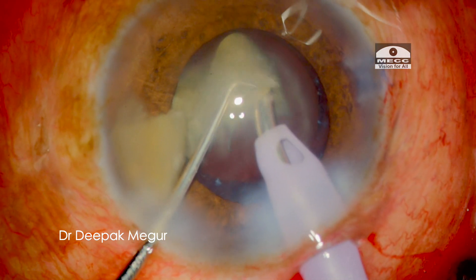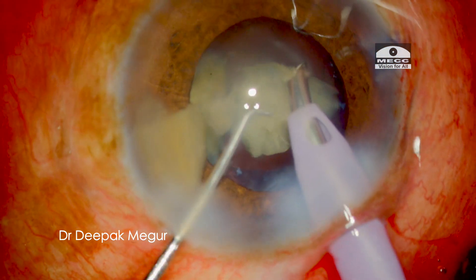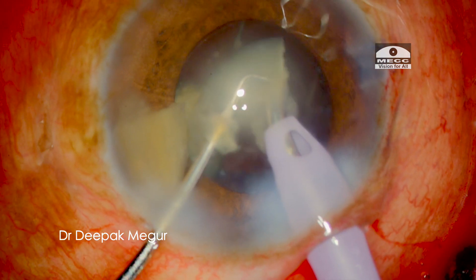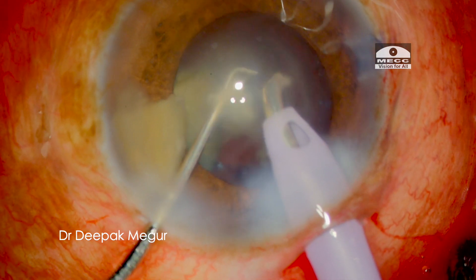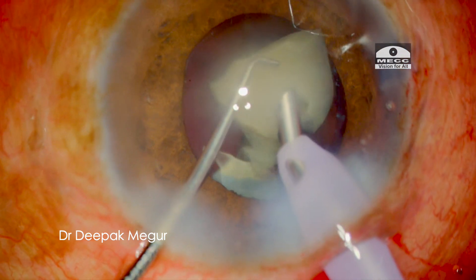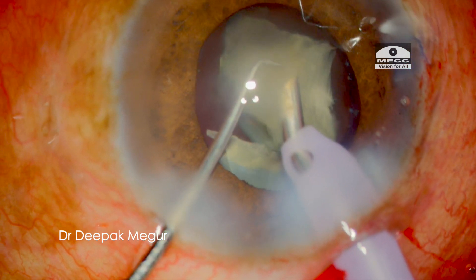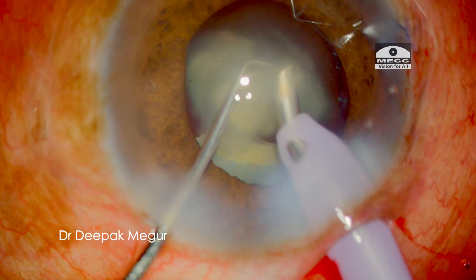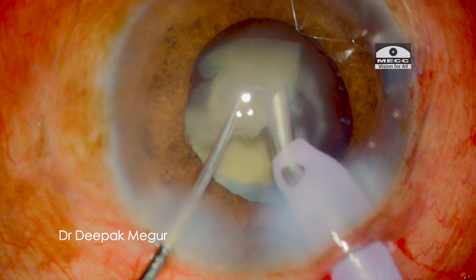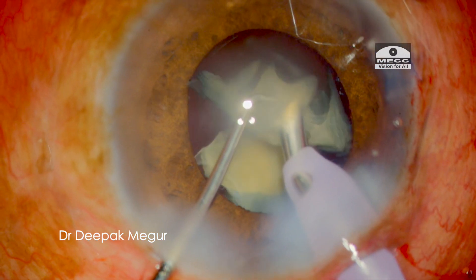The flow rate is reduced because in these elderly patients with Morgagnian cataracts, the bag will be very flimsy and loose, and sometimes when you use a very high flow rate the bag itself can get aspirated into the phaco tip — so you need to be mindful of that. During emulsification of fragments, I always try to keep my chopper above the level of the fragments to protect them from flying around or hitting the endothelium. Finally, each fragment is emulsified one by one.